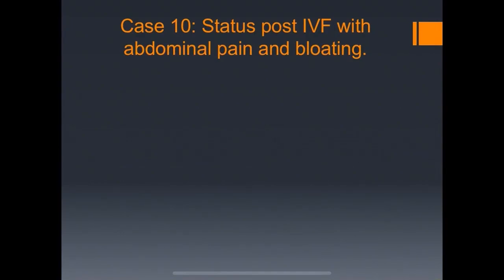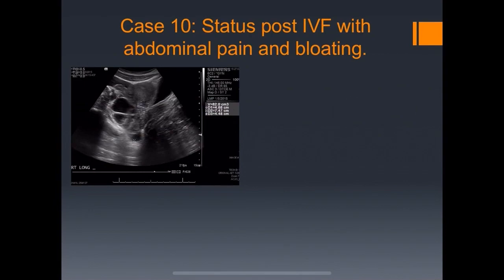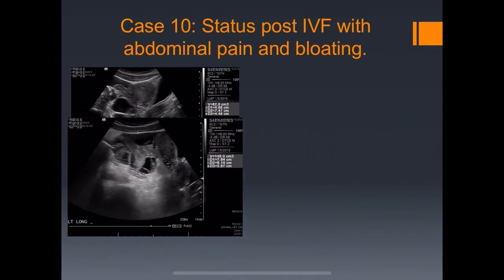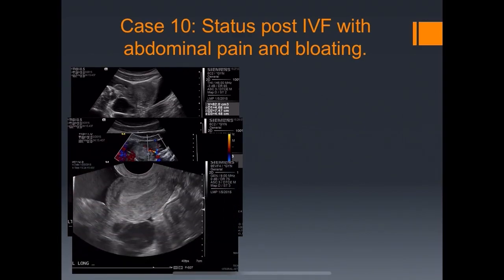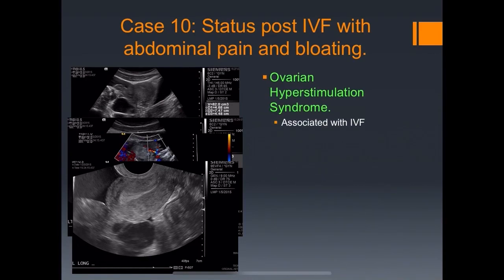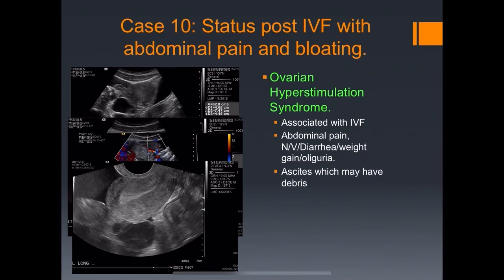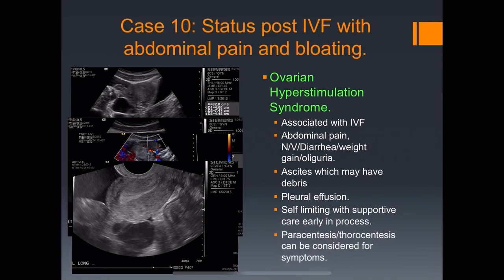Case ten: status post-IVF with abdominal pain and bloating. The right and left adnexa are enlarged with multiple cysts and flow present. A global pelvic view shows ascites with low-level echoes, possibly hemorrhage. This is typical of ovarian hyperstimulation syndrome associated with IVF. Symptoms include abdominal pain, nausea, vomiting, diarrhea, weight gain, oliguria, and shortness of breath. They develop ascites with debris and pleural effusions. It's usually self-limiting with supportive care; occasionally paracentesis or thoracentesis may be performed.